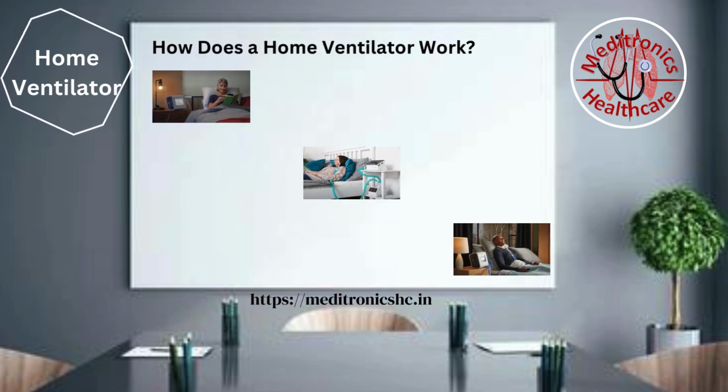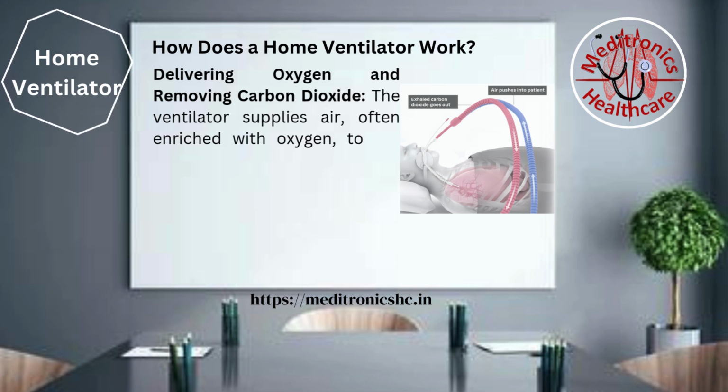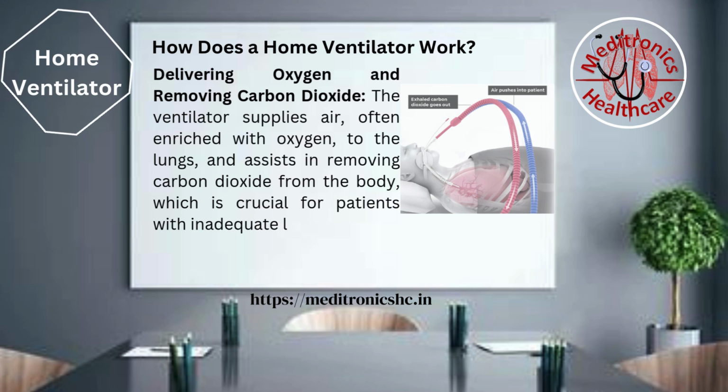How does a home ventilator work? Delivering oxygen and removing carbon dioxide, the ventilator supplies air, often enriched with oxygen, to the lungs, and assists in removing carbon dioxide from the body, which is crucial for patients with inadequate lung function.